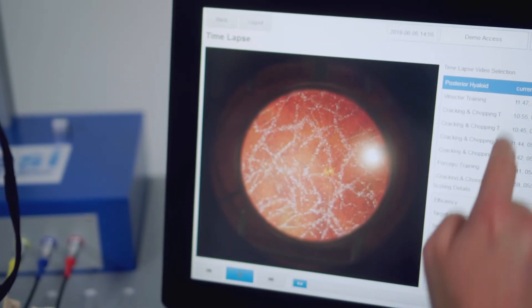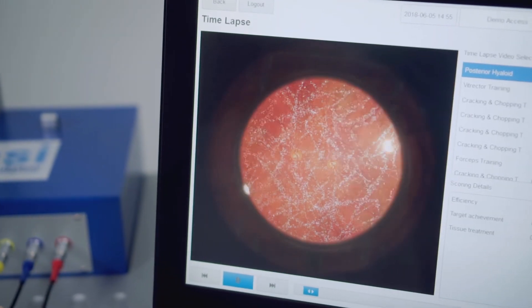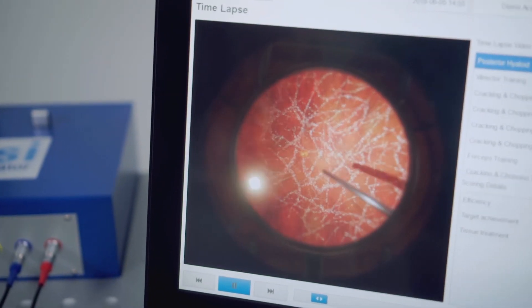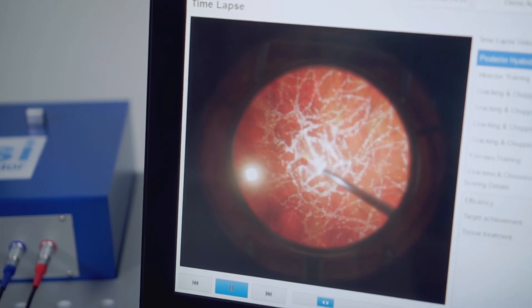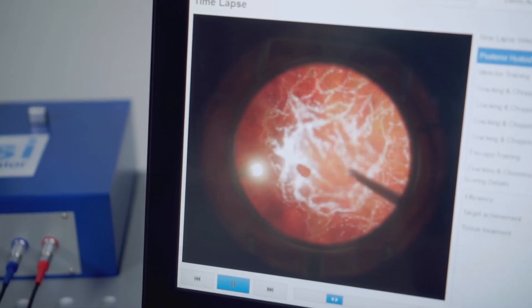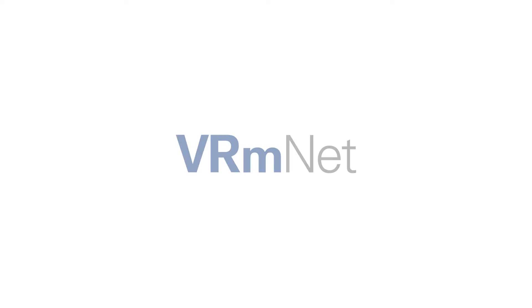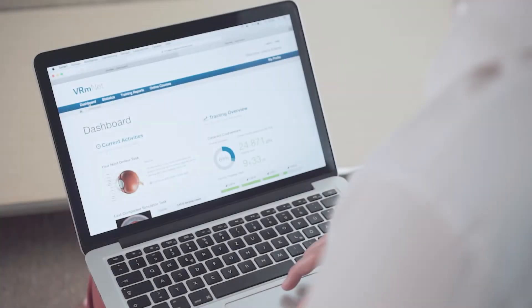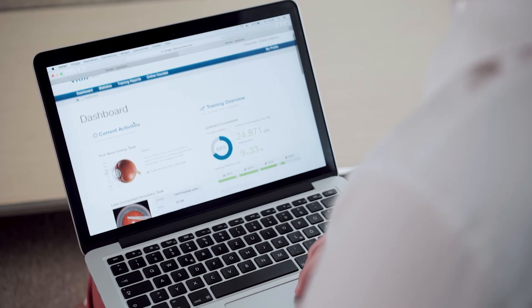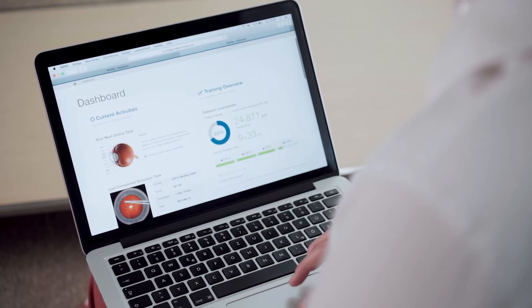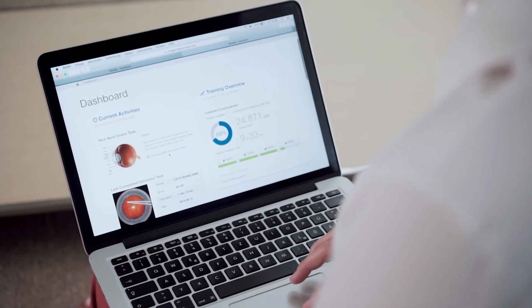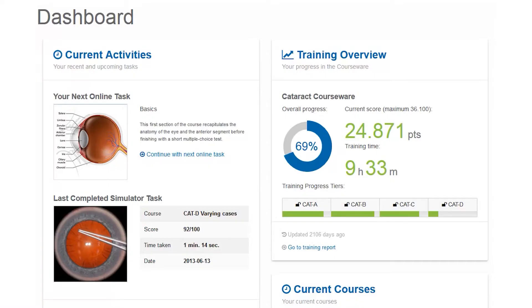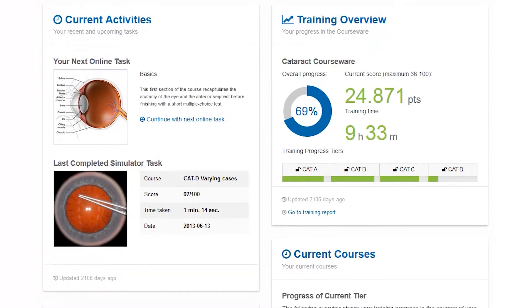At the end of each task, IC provides a detailed assessment of the surgical performance. VRM-NET allows trainees to access their personal training data and peer group comparisons from any mobile device.